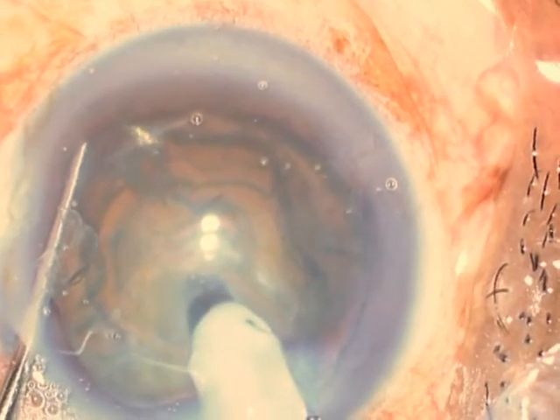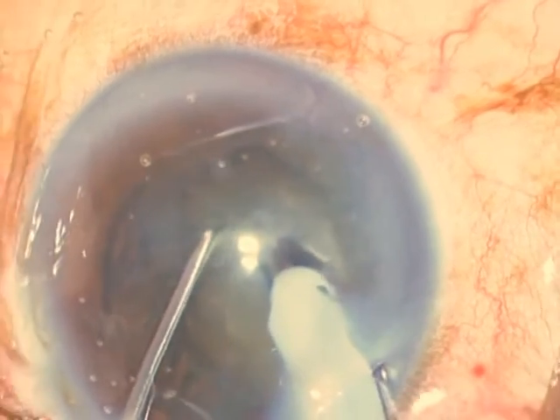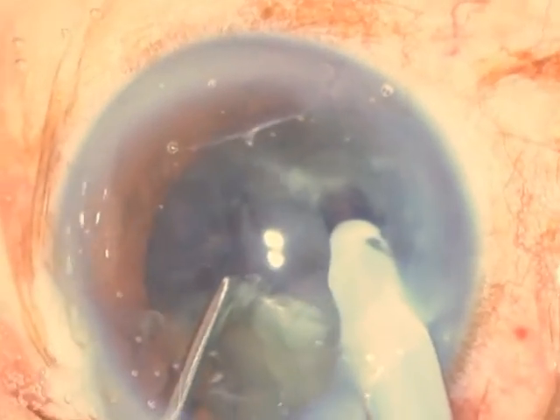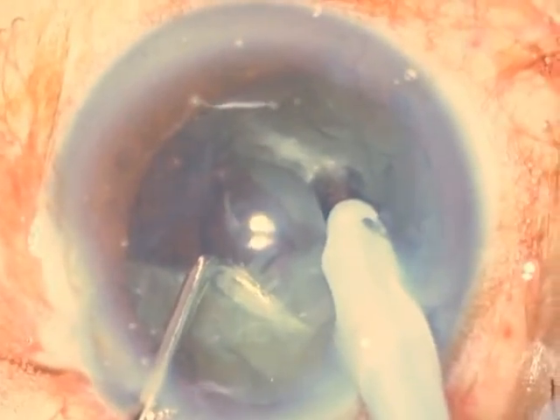I've taken the Chang horizontal chopper below the rhexis rim and under the epinuclear shell to the equator of the nucleus. I now impale the phaco tip into the nucleus and then draw the horizontal chopper towards the nucleus tip.